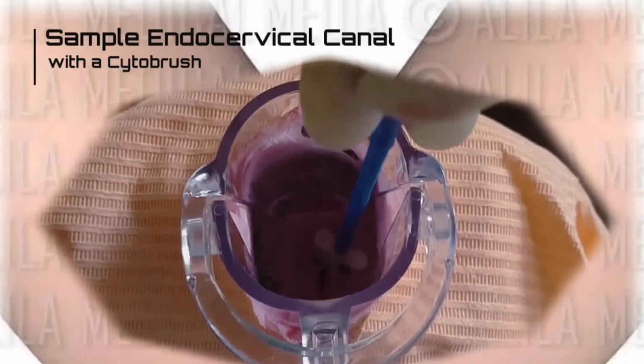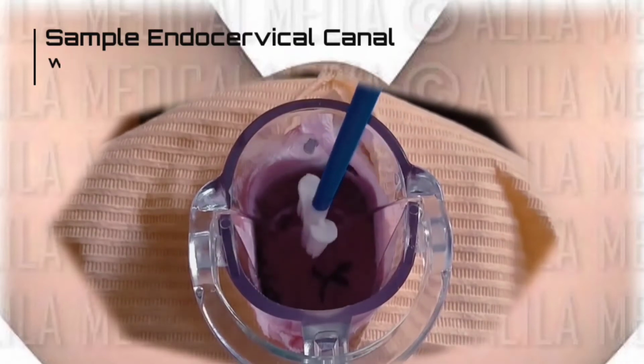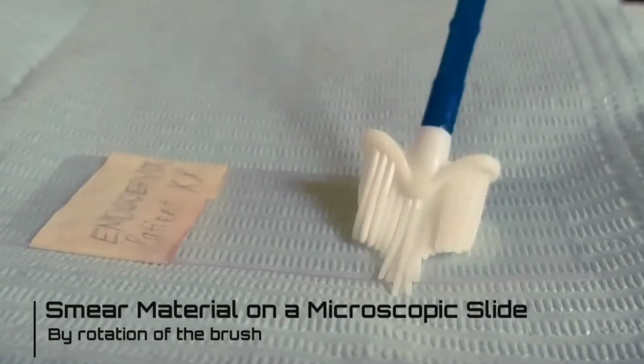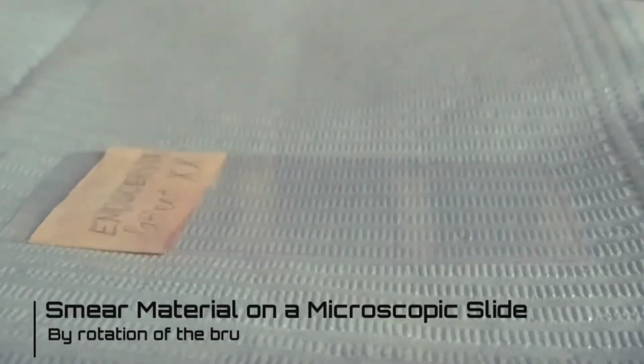Sample the cervical canal with a Cytobrush, which is placed into the canal and rotated. The material obtained is then smeared thinly on a microscopic slide by the rotation of the brush on the glass surface. This should be labeled Endocervix.